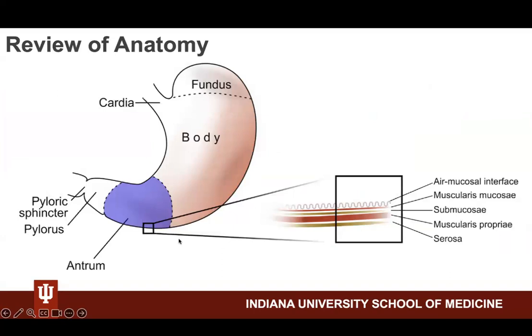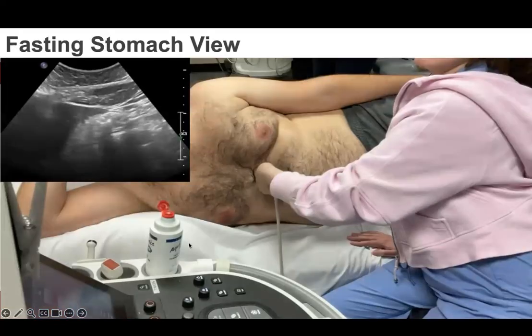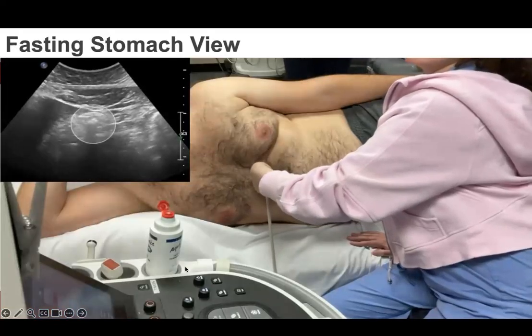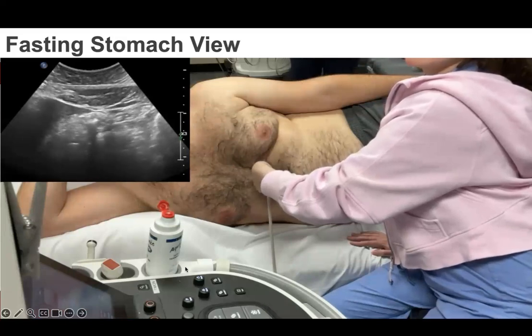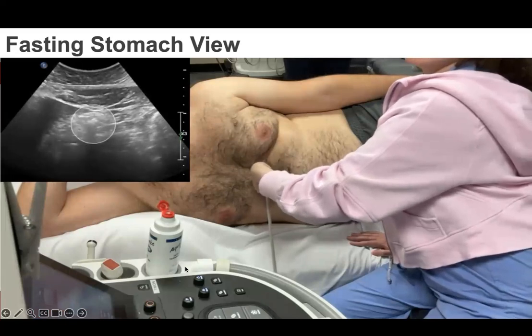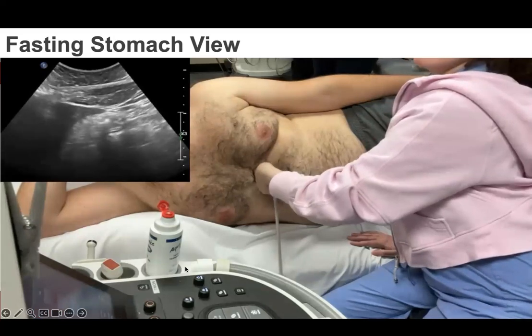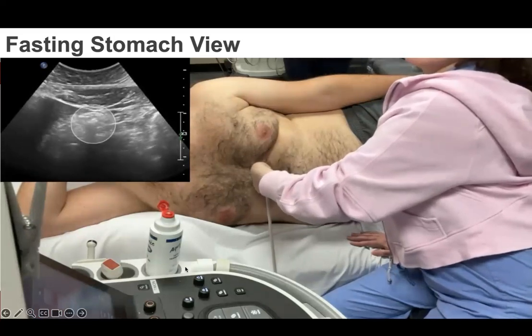As mentioned, our goal is to visualize the gastric antrum conveniently located in a gravity-dependent position, highlighted in purple. Take a moment to briefly familiarize yourself with the anatomy visualized with the ultrasound. Here, our model is lying in the right lateral decubitus position, and as I scan, the liver is immediately in view, followed by an empty gastric antrum. Assuming the antrum is also empty with the patient in the supine position, the antrum would be a grade 0, suggesting low risk of aspiration.